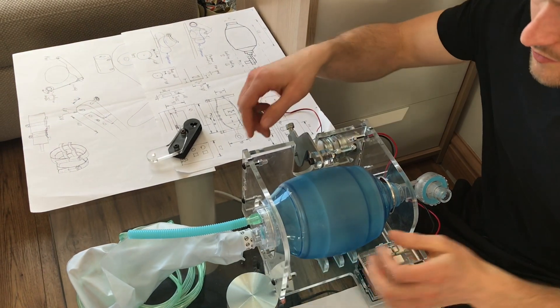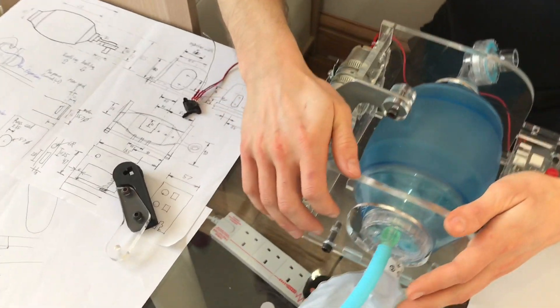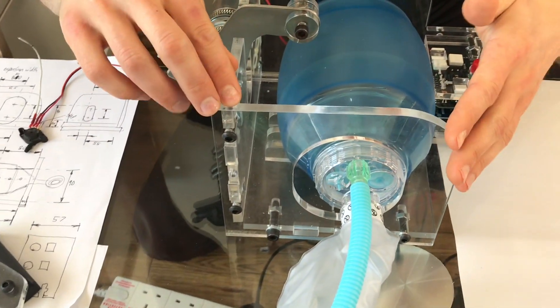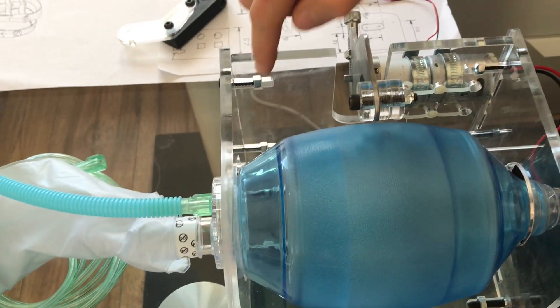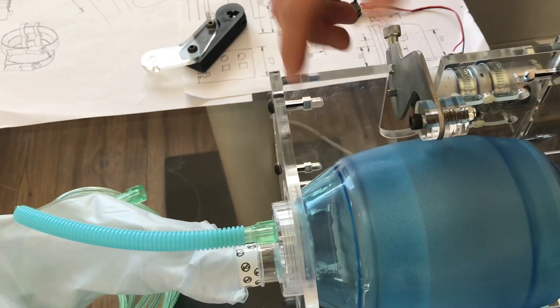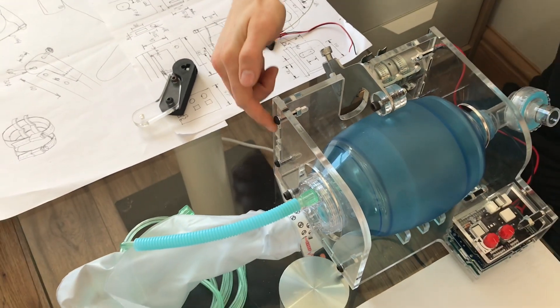The way the whole frame is constructed is with captive nut and bolt arrangements. All this frame is laser cut from acrylic, but it can be laser cut from plywood, MDF, or even metal. It assembles really easily and only takes a minute or two because it's all just nuts and bolts with these finger joints.